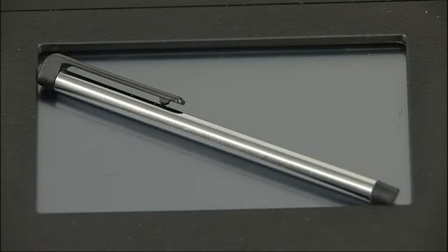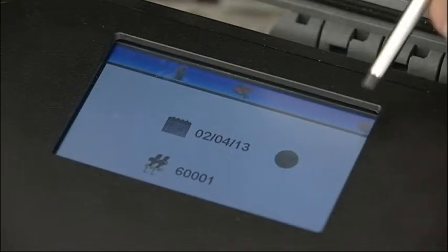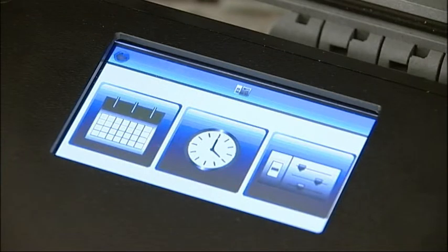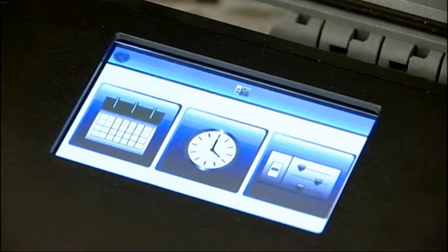A stylus pen is provided for use with the touchscreen. Press the arrow key to progress to the main menu. To change the configuration settings, press the right-hand button. From the sub-menu, you can set the date, time, units of measure and breathing air test standard.